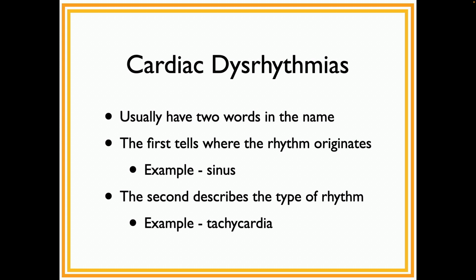So as part of the name of every dysrhythmia, the first tells you something very important, where the rhythm originates, okay? The second tells you something about that rhythm.